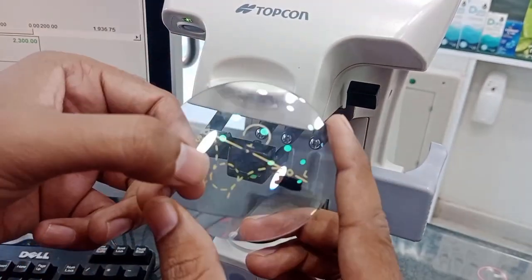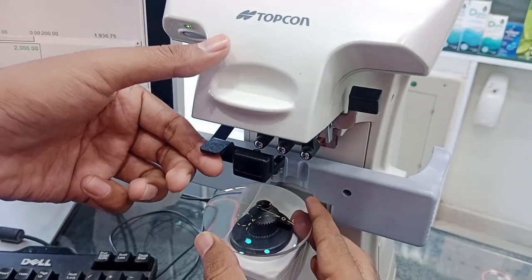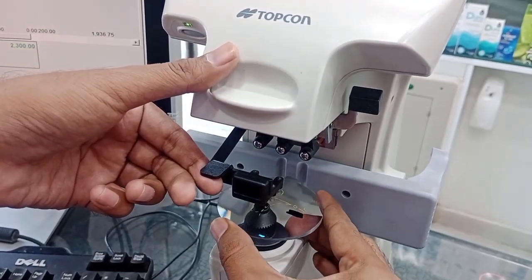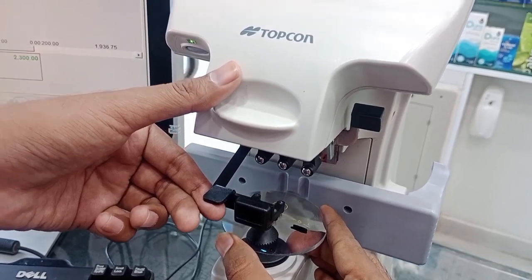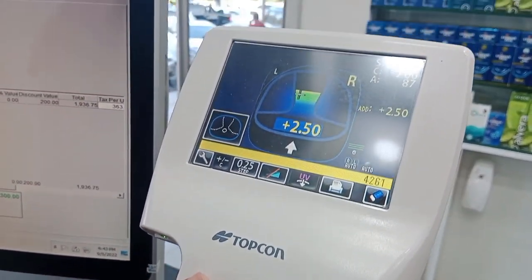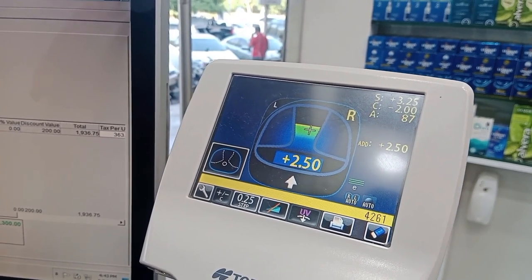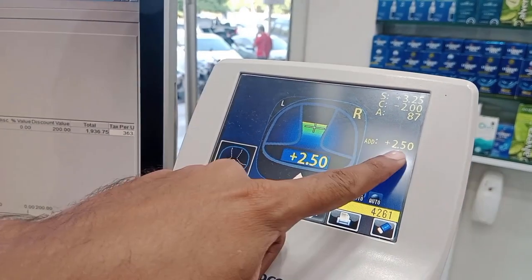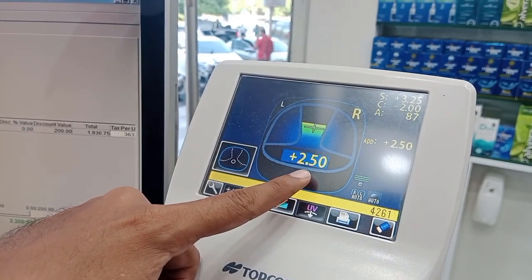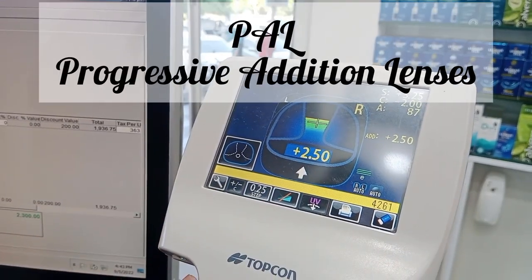For the near reading, I move the near circle portion beneath the lens holder. The plus sign should be exactly at the center of the near zone. The addition reading is plus 2.50. In this way we can find both the near addition and distance power in progressive addition lenses.